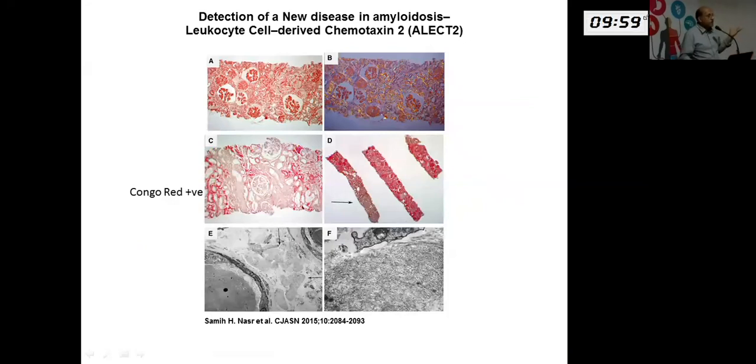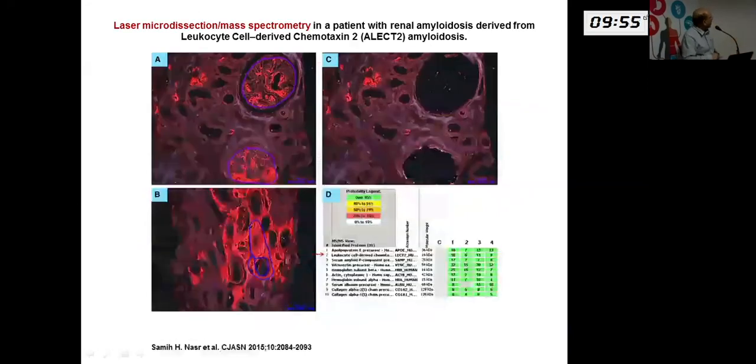Now, what is this made of? It is possible today to laser microdissect. Can you see this? This is a glomerulus that has been marked out. Using laser, you can cut this, remove it. Look, it's been catapulted into a tray. These two are cut, catapulted out. This is the remaining tissue, and the catapulted tissue is subjected to mass spectrometry.